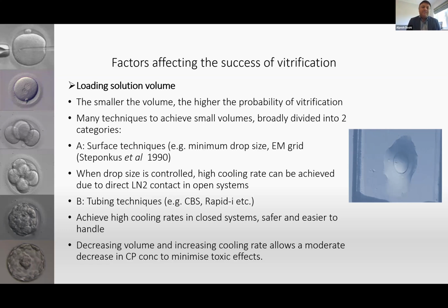You really need to try and make the smallest drop, or even if you've made a drop, you need to try and remove all the excess media in which the embryo is sitting. Some embryologists call it the drag and drop, or drop and drag method, whereby you make a drop, then pull a slight extension of that media, and from the other side, just aspirate all the excess amount of media. But the long and short of it is that you want to make the tiniest drop possible in which your egg is sitting. This will influence the cooling rate. This will give you the maximum cooling rate during the procedure. With very large drops, you may be compromising the cooling rate and hence potentially the survival as well.